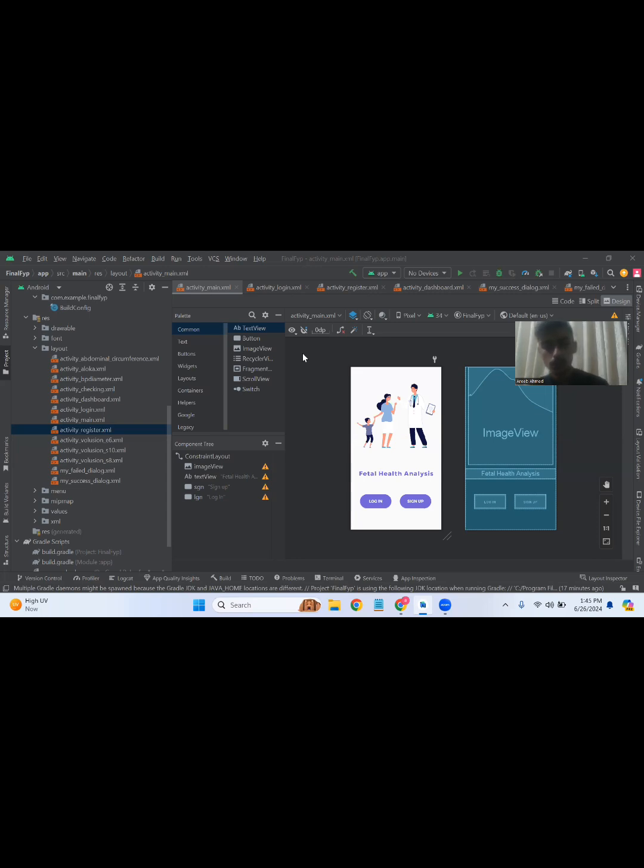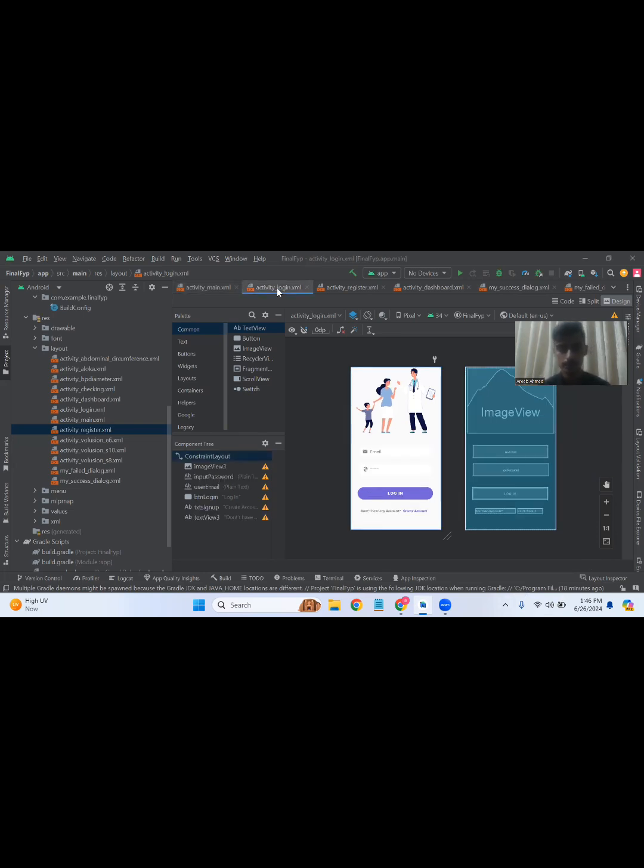Okay, so now we'll move on to our Android application that we have made for our project. We use Java as our programming language, and we use Android Studio as our main IDE to make this Android application. So first we made a main page from where we can move on to login and sign up, as you can see here. And now this is our login page, and this is our sign up activity.